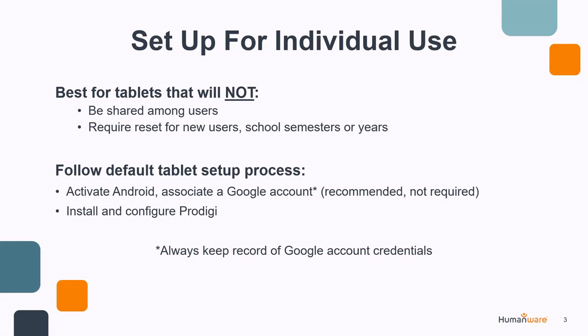To effect this individual use, you simply follow the default tablet setup process, and that is activating the tablet in Android with an associated Google account. Now, you'll notice the asterisk here. It is recommended that you associate a Google account. It's not required, but if you want to do anything on the Android side and download apps and send emails and so forth, a Google account is highly recommended. But you'll notice the asterisk again, and at the bottom, the note: always keep record of the Google account credentials. So the username and password.